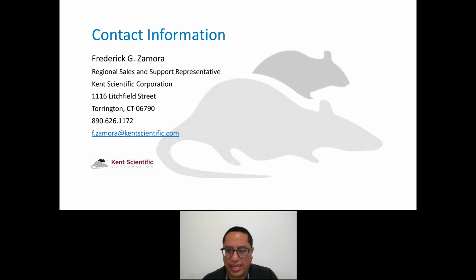Gotcha. Thank you again, Jackie. And thank you, Sarah KS. I was like, what's a KS induction? Kent Scientific. Let's see. Yeah, so with the chambers and circuits, you are certainly welcome to use whatever induction chambers you have. You'll just most likely need to provide the proper connectors that will connect the tubing to your specific chamber. So if you reach out to us, we can give you the dimensions of those tubings and connectors, and we can go from there.